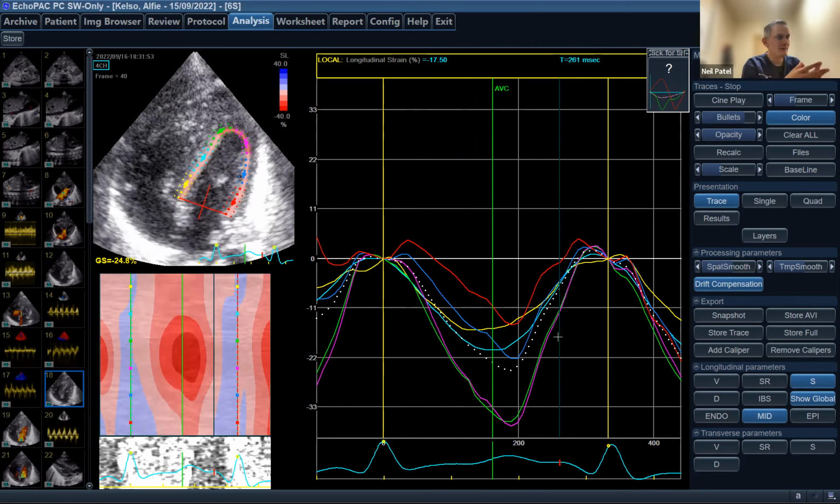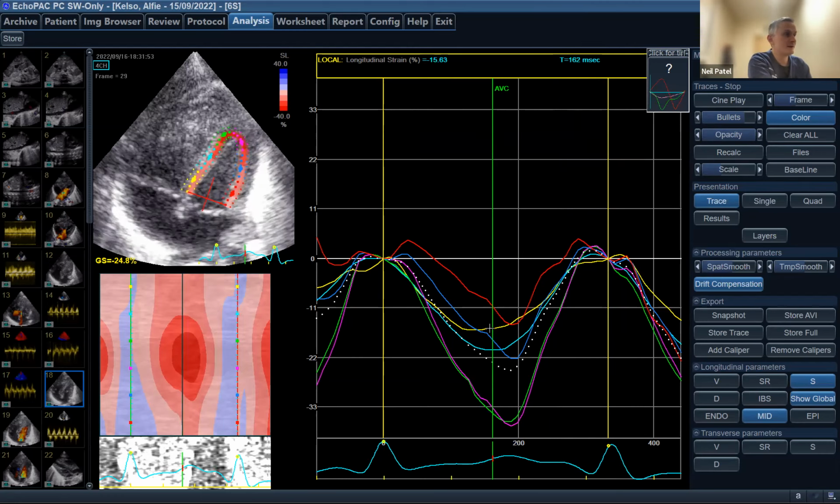And you can imagine that in a ventricle, if the segments are not all reaching peak strain or peak shortening at the same time, that will affect the global ability of that ventricle to be working fully and ejecting as efficiently as it could. So it's not something that's been really well studied in babies. It's something we looked at in the congenital diaphragmatic hernia cohort and saw, compared to controls, quite significant changes in their synchrony.